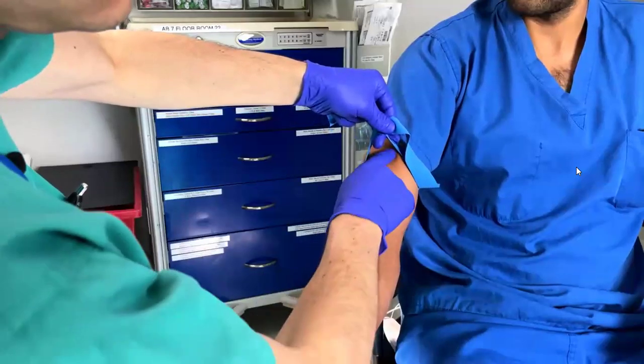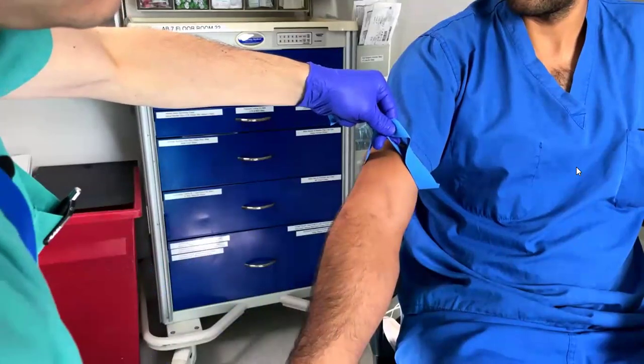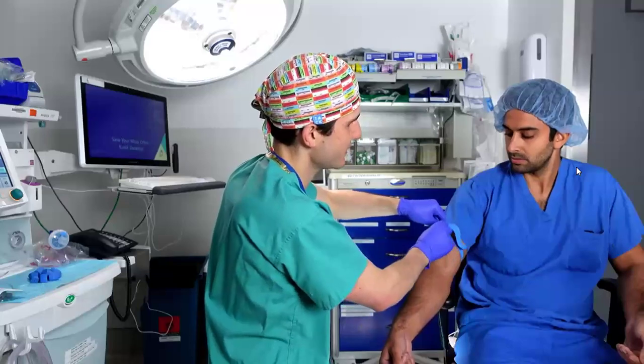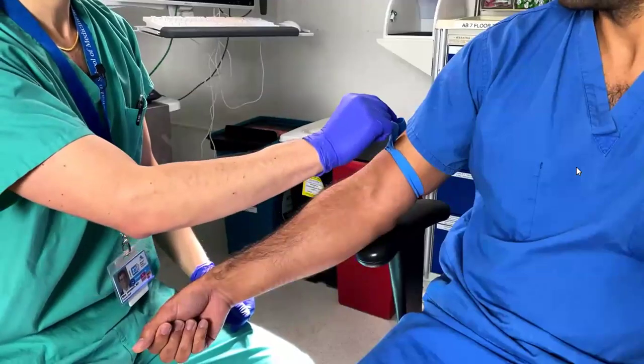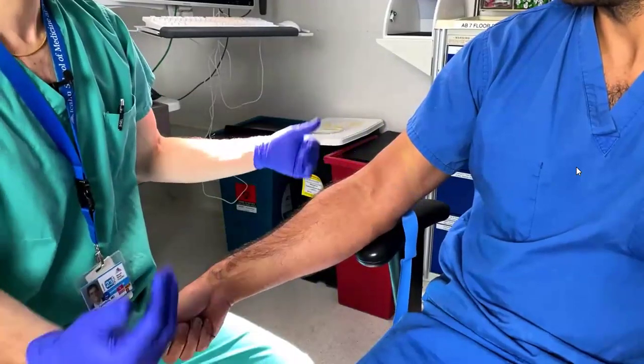I also want to point out that this strategy allows me to make a tourniquet as tight as I need to while maintaining space in between the tourniquet and the patient's arm so that body hair is not pulled tight, which can be very uncomfortable for patients. This particular strategy is very nice for a quick release. All that I need to do is pull a little bit on this end and the entire tourniquet undoes itself.